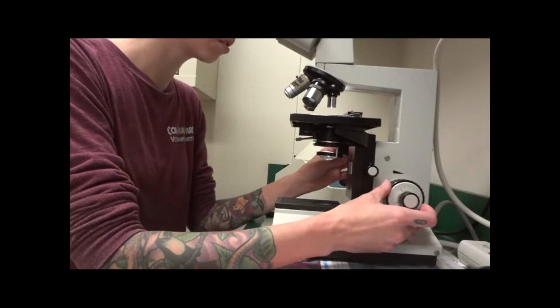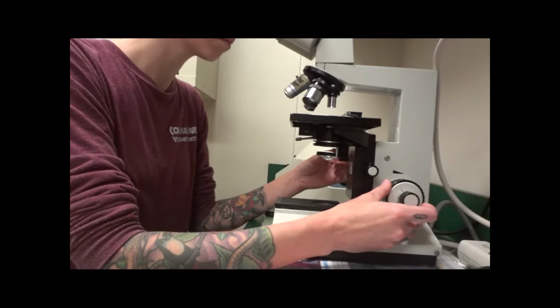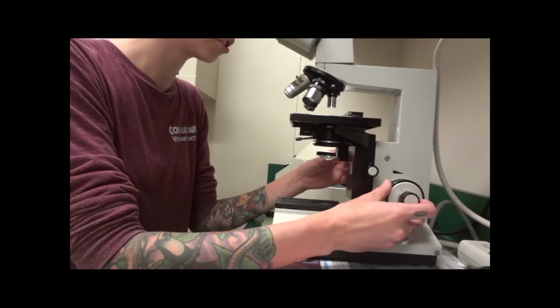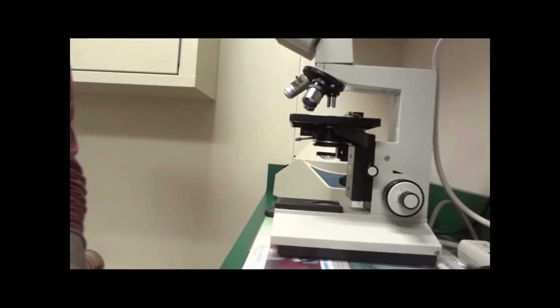There's definitely bacteria in here. We've got red blood cells in here, obviously. Nuclei are still present in our epithelial cells. Not seeing any angular cells yet. So I believe our dog is in proestrus. We decided that the patient that we performed a vaginal cytology on is in proestrus.